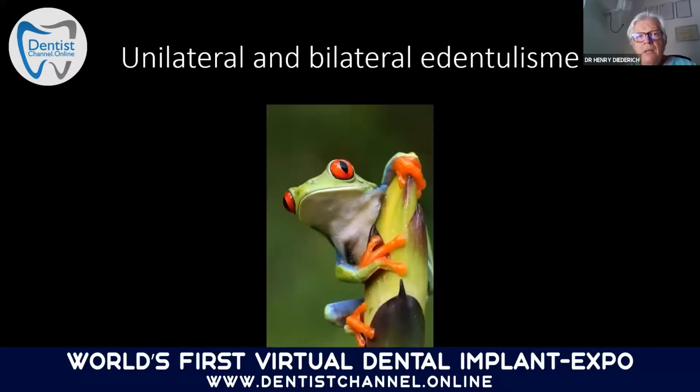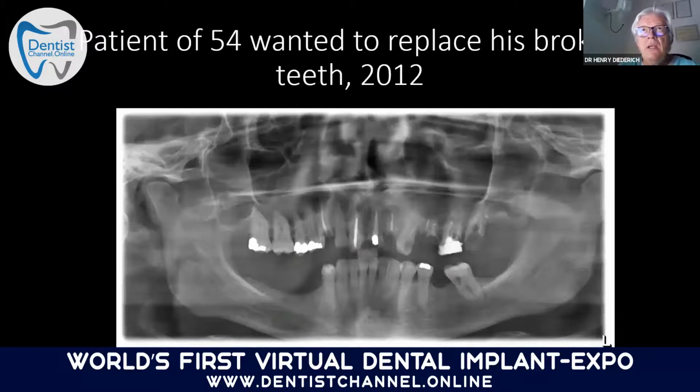So now let's see unilateral and bilateral. What is so wonderful in this technique is that we may do all cases, not only like All-on-Four, where you need, of course, a total maxilla, but here we may work also partial, bilateral, unilateral, or total. So this patient, 54 years young, wanted to replace his broken teeth on the left maxilla side. Case done in 2012.